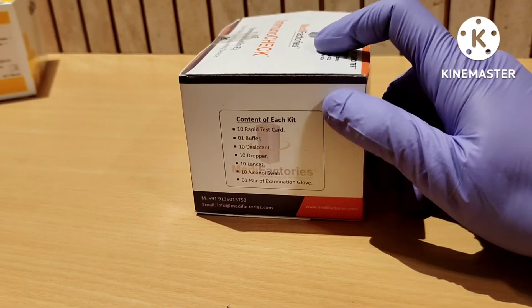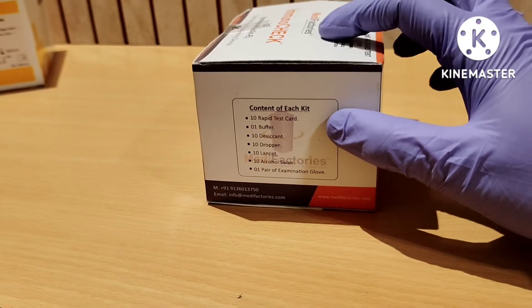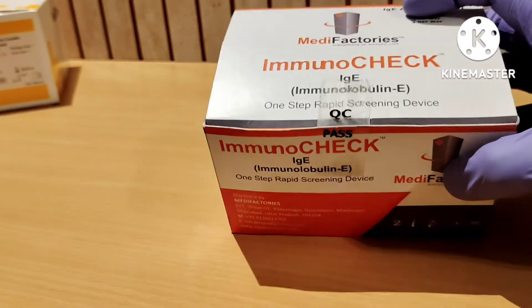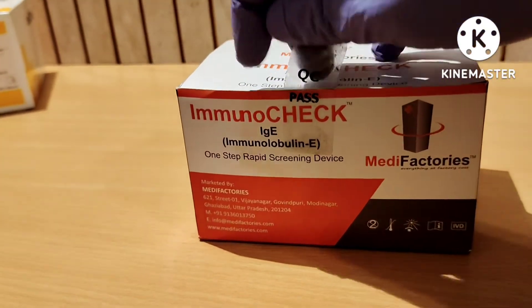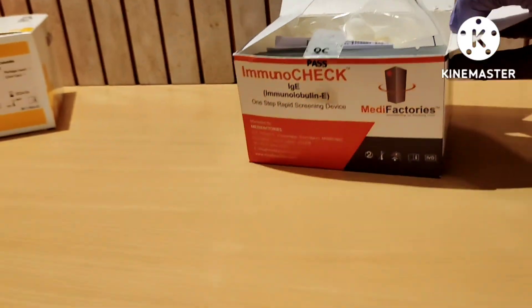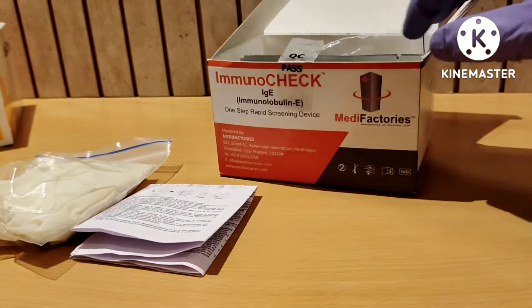Here you can see the content list of this kit: rapid test card, buffer, desiccant, dropper, lancet, alcohol swab, and one pair of examination gloves. You can clearly see the QC passed check — this box is QC passed. We have to remove this sticker, and when we open the box you will get 10 test cards inside, one pair of examination gloves, and an instruction manual.